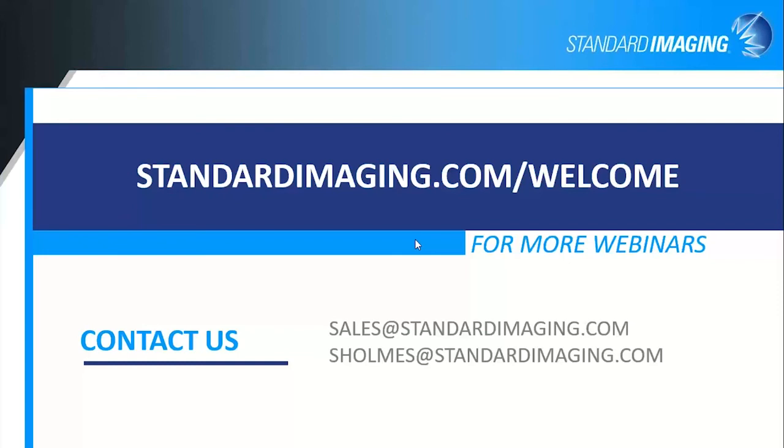So Eric asks, in the paper by Paulina Galavis, they saw a relatively large change when switching between parallel and perpendicular orientations. I do have a comment on that. They had one of the prototype units for the Max SD, and we discovered after the fact that they had a particular piece within the optics that had an anti-reflective coating on it that was colored compared to the clear that we normally get for that particular part. And so we suspect that the variation they saw, as well as the lower CLR value that they saw compared to the value of 1 that we expect for most of the Max SD units, came from that color change.